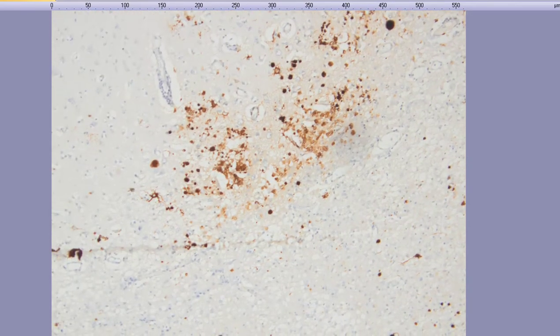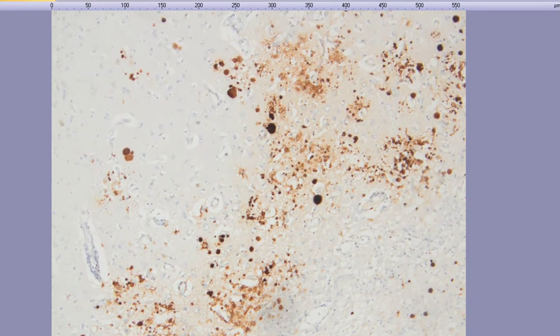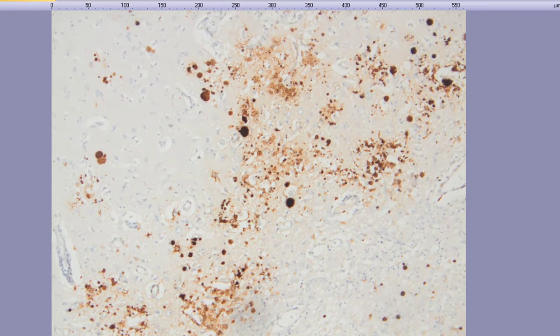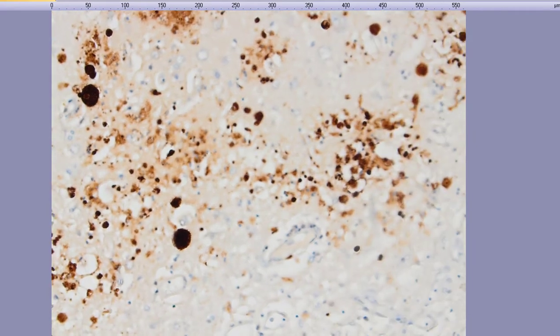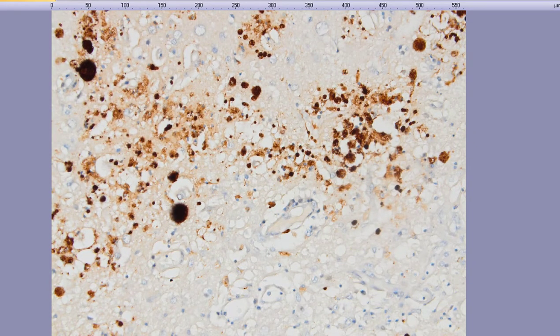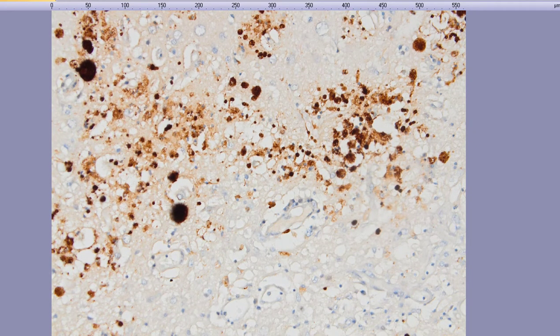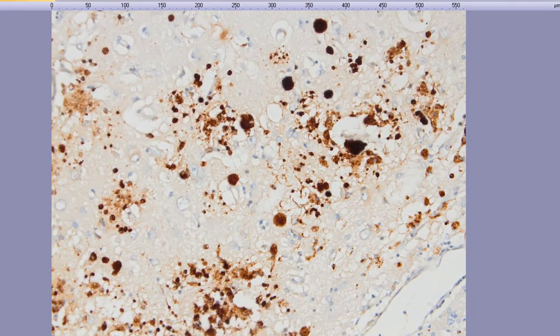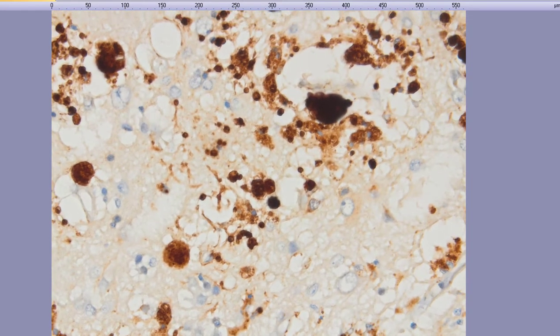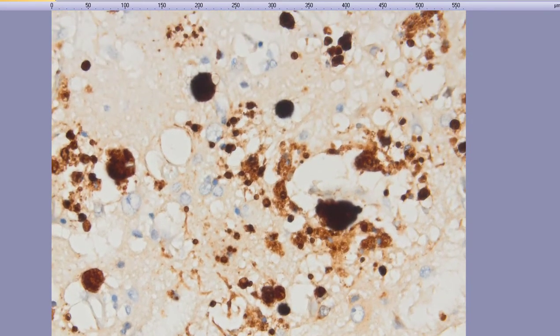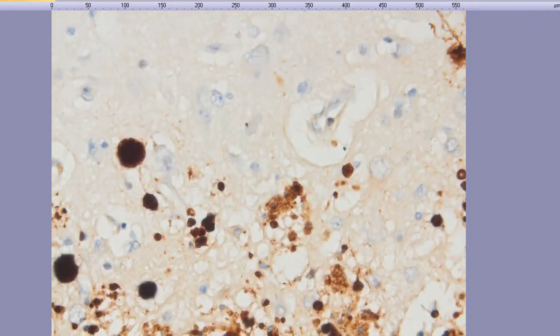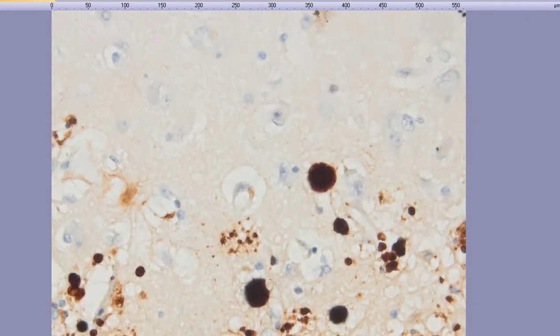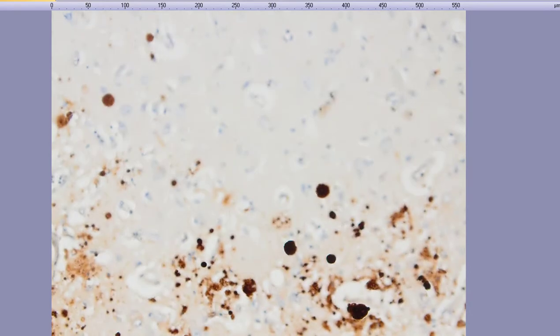And at areas of necrosis, you've also got the free tachyzoites, the smaller dot-like staining. Amongst the inflammatory cells, you've got these tachyzoites, smaller dots, as well as these encased bradyzoites.